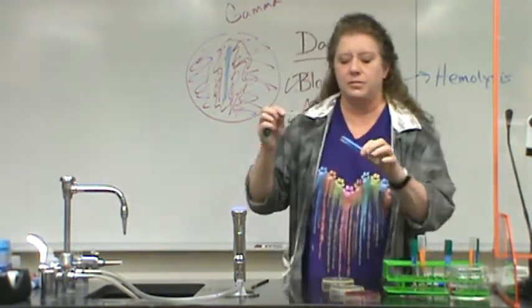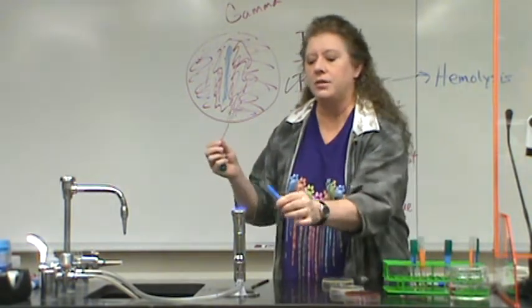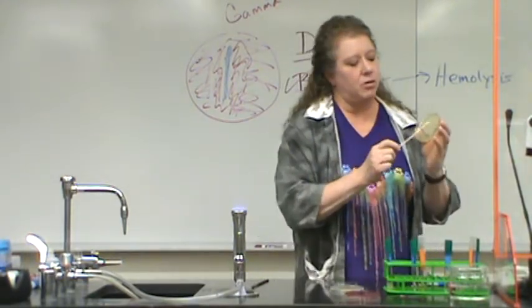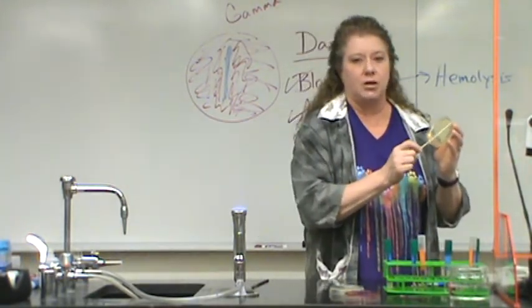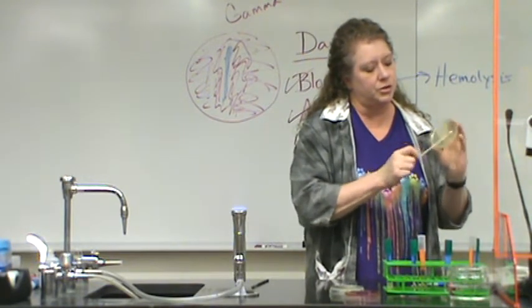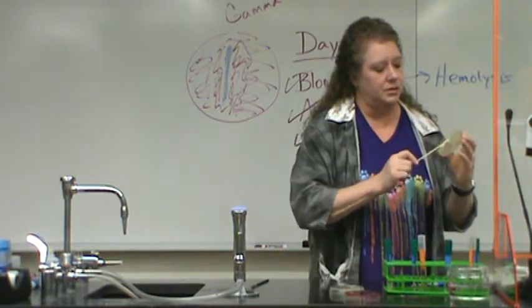Remove the lid, flame the top, moisten your swab, flame the top. And then remember, you've got to make a lawn, and you want a nice complete lawn. Go around the edges, go back and forth, keep turning the plate. Nice solid lawn of bacteria.